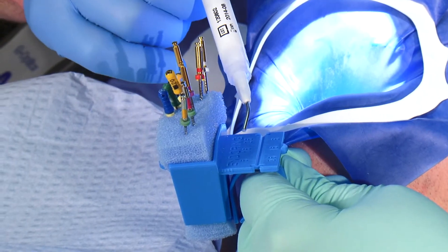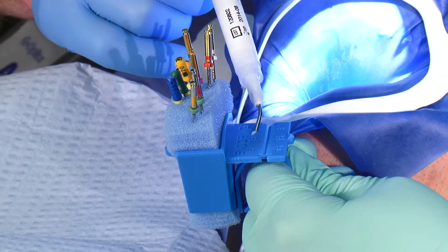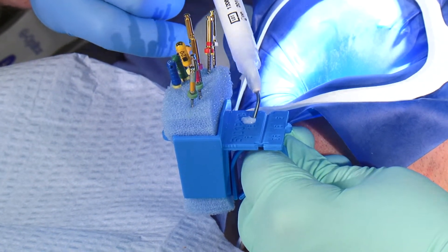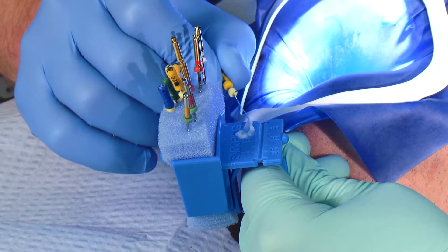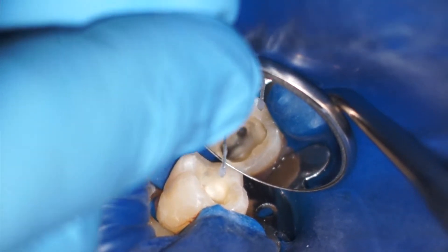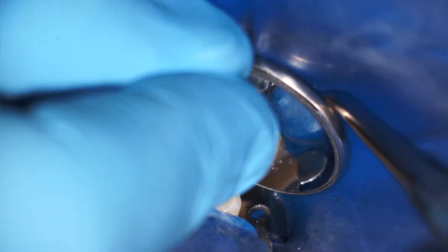Let me show you how I use it in my practice. Some of my colleagues like to put some Glide directly into the pulp chamber. I prefer to put some on an endo ring, or you can use a mixing pad. You coat the files, like this, and then work them into the canal. I do it this way because I get better visibility into the canal.